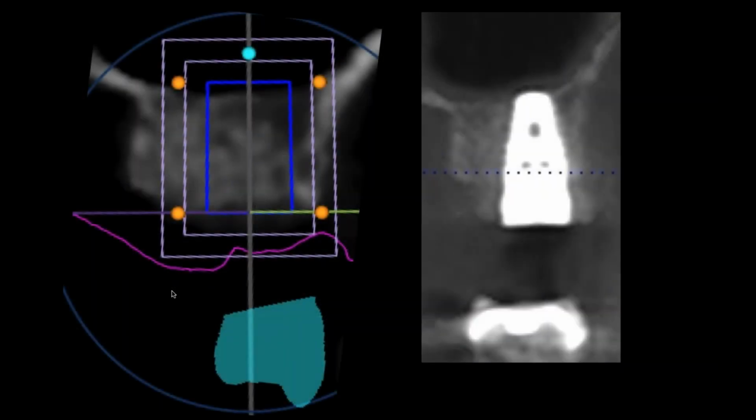And you can see, if you look on the left, you see the blue, you see the plan, and sure enough, on the right, it's pretty close. And so this is within a pretty good jumping distance of being right. You notice on the right side here, the inclination is going toward the working cusp of the opposite arch, which is what you want.